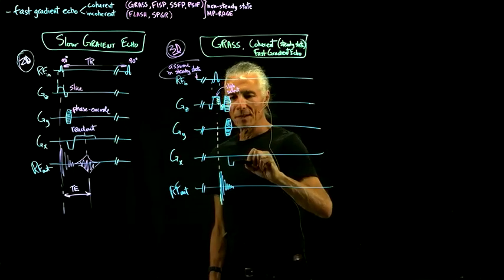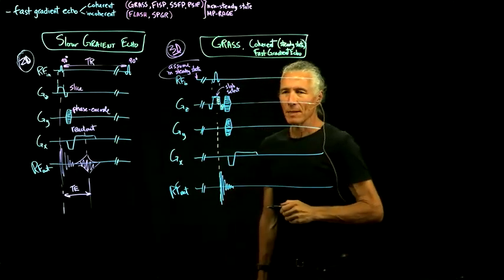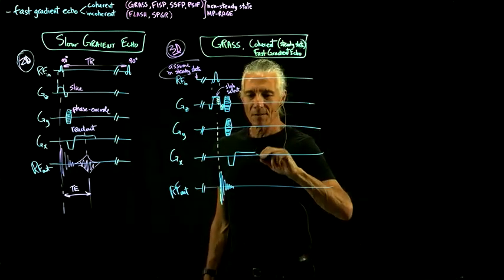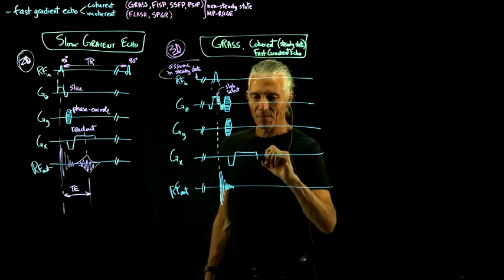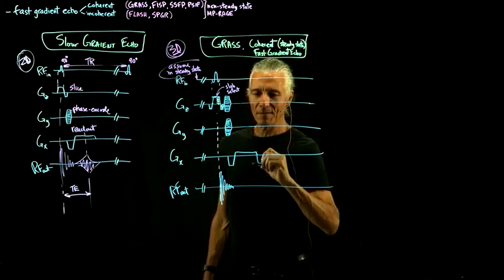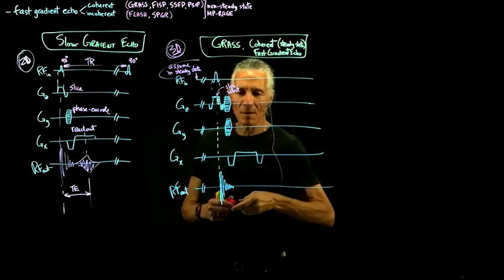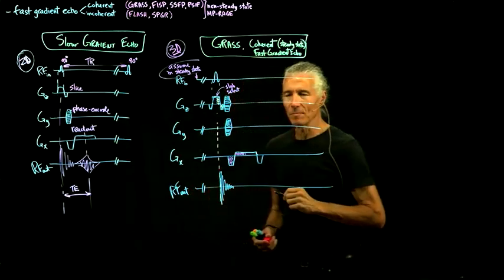So go to the left side of k-space and then go all the way across k-space. But now, since we're going to try to save all our magnetization, we have to essentially fix the fact that we went across k-space. And so remember, those areas are supposed to be equal.